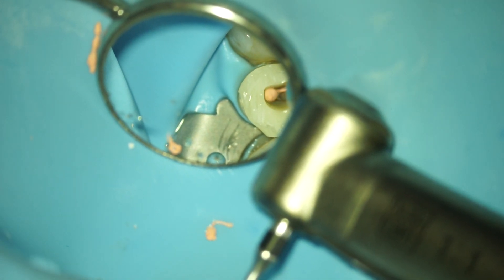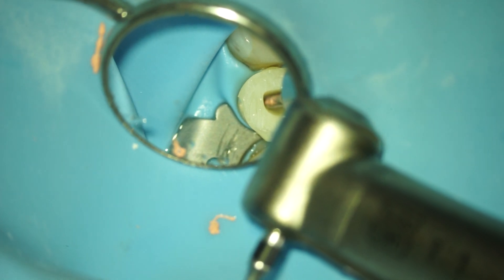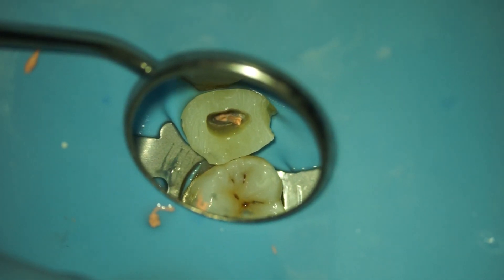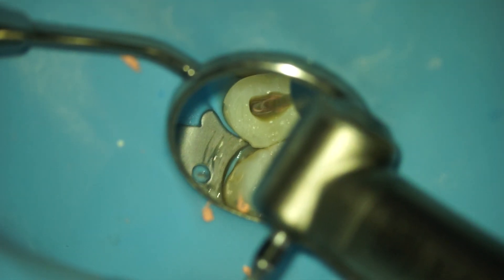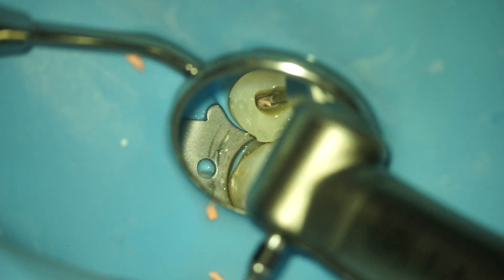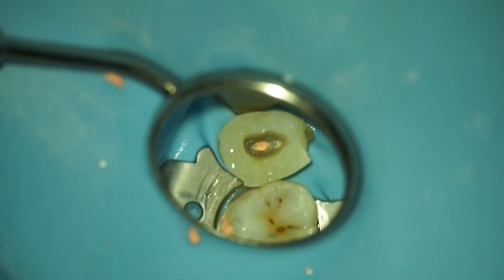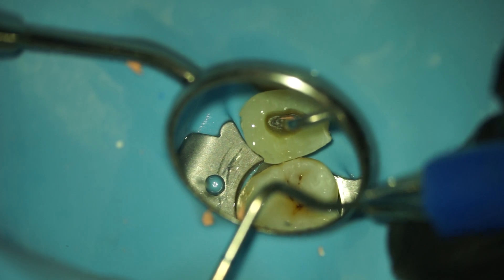After this, I prepare the post space. If you look very carefully, you will see that I use a pretty small burr and that I rather thermomechanically plasticize the gutta percha to remove it. Always adapt the post to the canal — never the canal to the post. Then I use a plugger to make sure that everything is well adapted in the apical part.